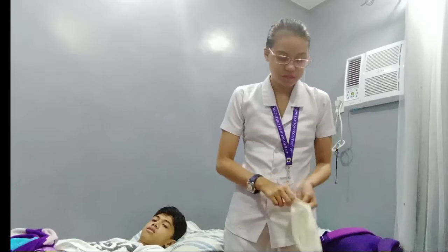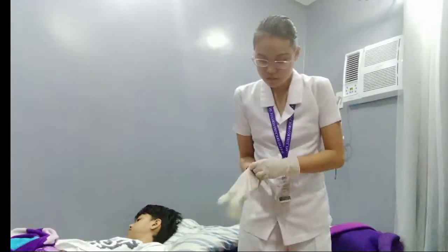Afterwards, we need to remove the needle cap by pulling it straight off. Hold the syringe between the thumb and forefinger of your dominant hand as if you are holding a dart. Again, use your dominant hand since this is what you're most used to and provides more force and support. But before we do that, we first need to glove to avoid cross-contamination.